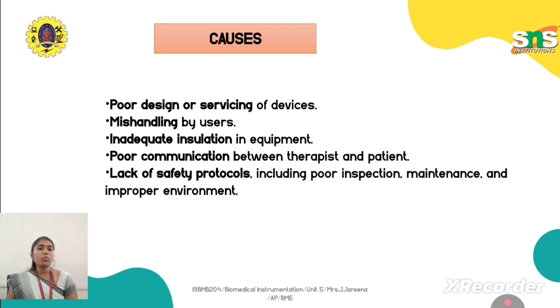And also the second point is mishandling by the users. The user should be trained to use that particular device in the proper manner, else mishandling will also lead to shock. Okay, third one is inadequate insulation in the equipment.